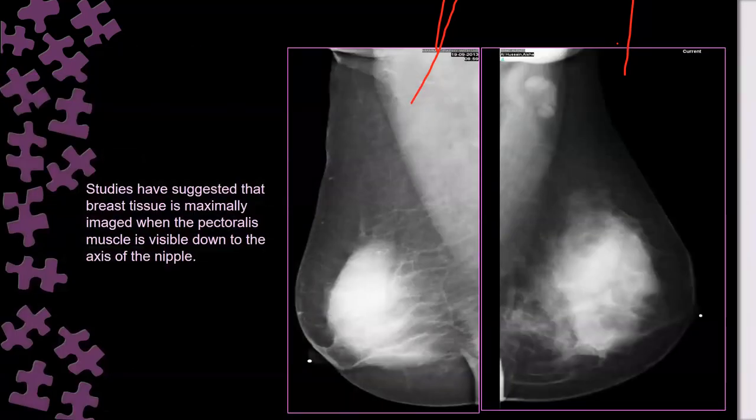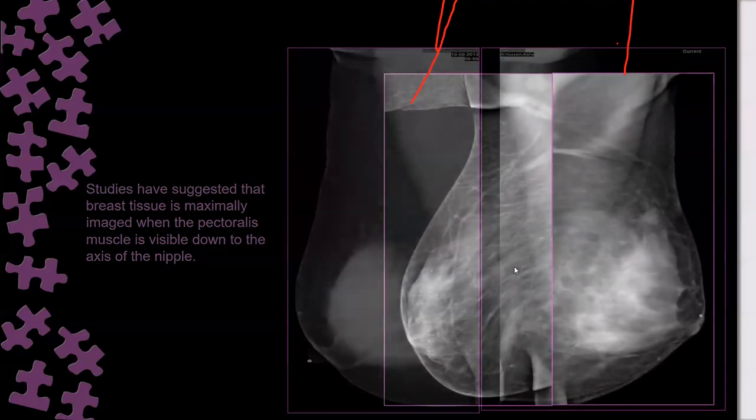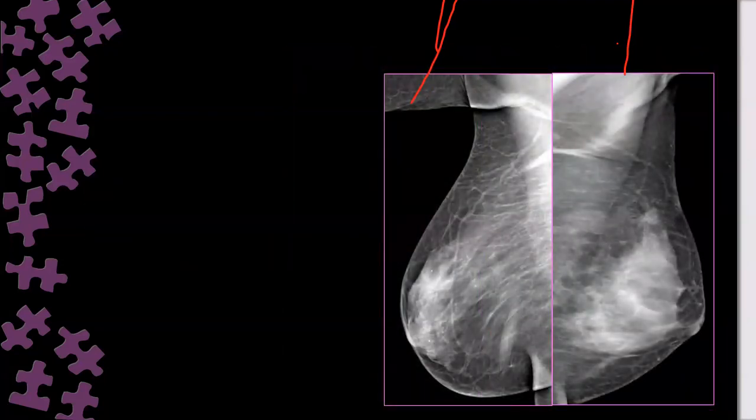And this one? This one too, the inframammary fold bilaterally is not visible, not clearly open. No, the inframammary fold is open. The left one is slightly folded, a skin fold. But this one is open. But here the border is not visible clearly. Yes, that is the only issue. This is also my patient, and this is also my patient.